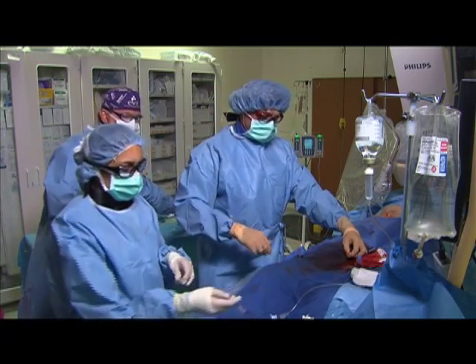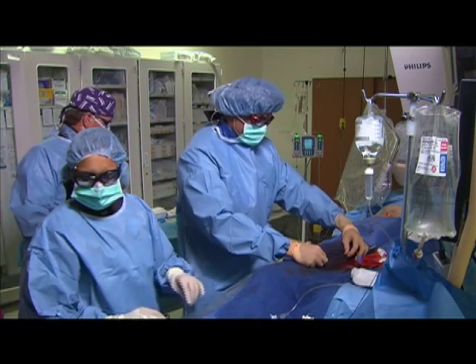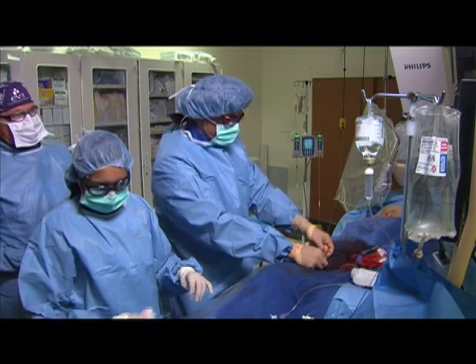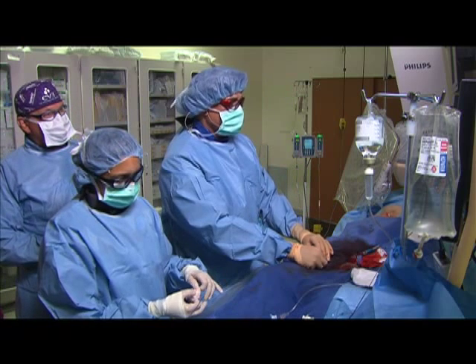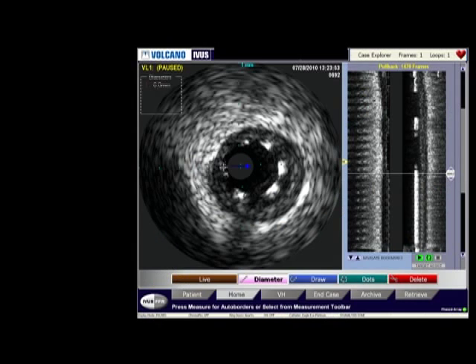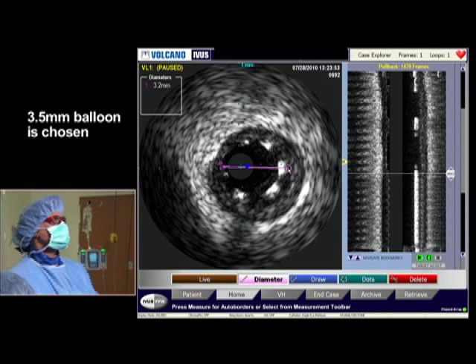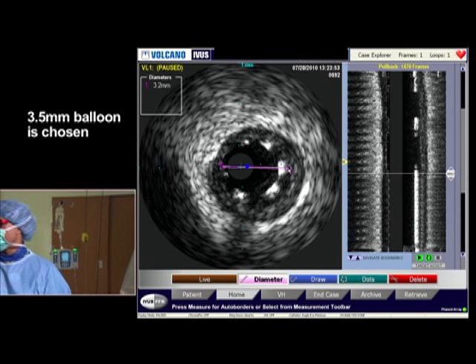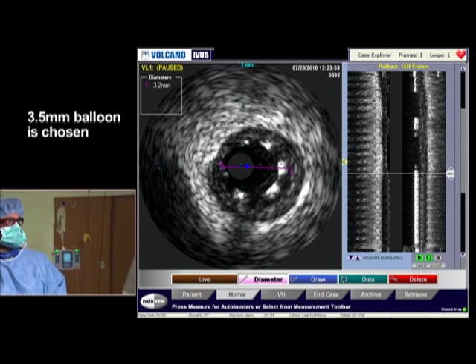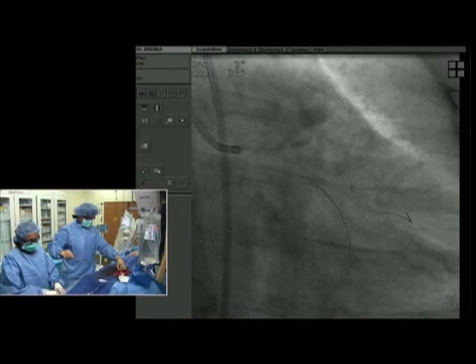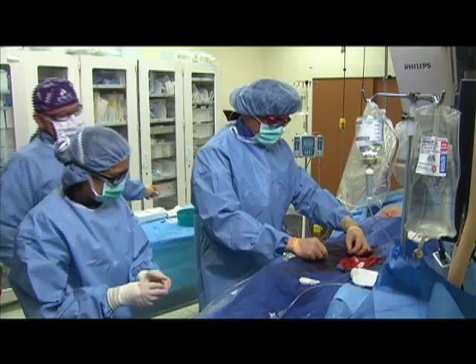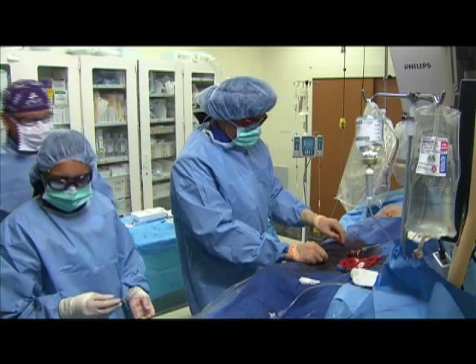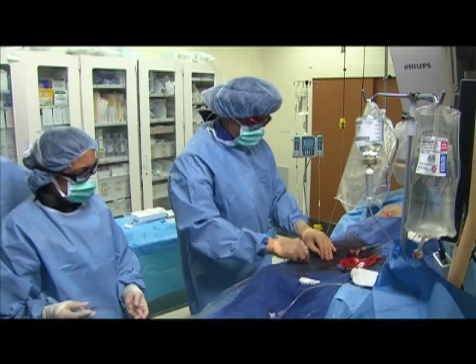That's why we usually do bifurcations with intravascular ultrasound. Because the vessel is 3.5 to 4.0, we don't want to overexpand the stent, so we'll take a 3.5 at 15 atmospheres, which should be enough. We'll do a quick IVUS to make sure it's apposed, and if that's good, then we are done.